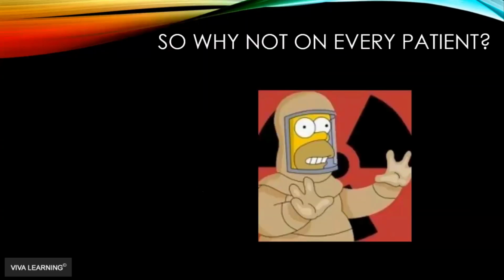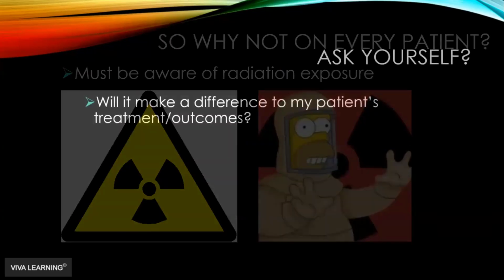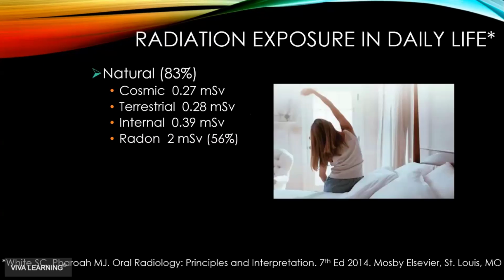So if it's really cool, why don't we do it on every patient? Well, we have to be aware of radiation exposure. What we need to do is ask ourselves, will it make a difference to my patient's treatment or outcomes? What is my ROI? Not my return on investment, but my return on irradiation. Do I really need this to get the diagnostic information that I require? And you will be able to see that in actual fact, a lot of times, yes, you do.